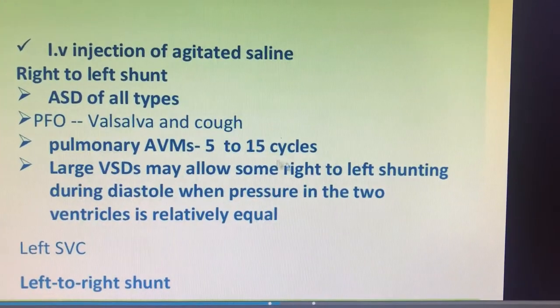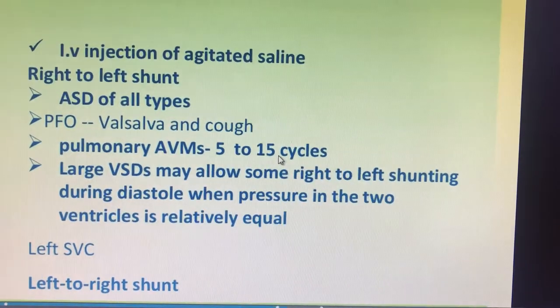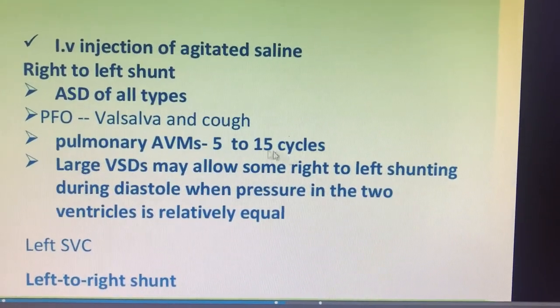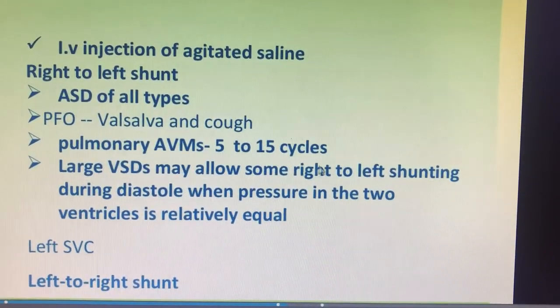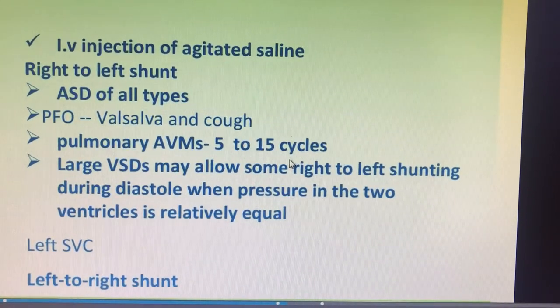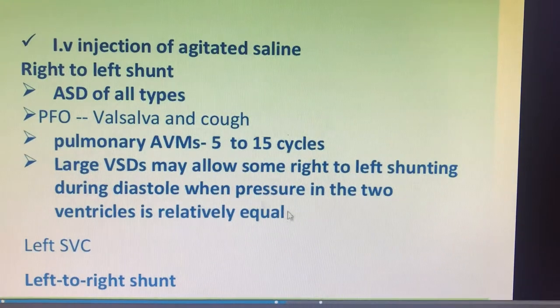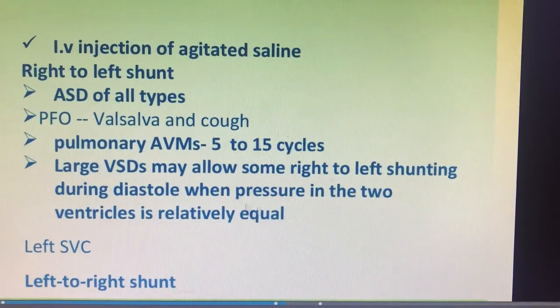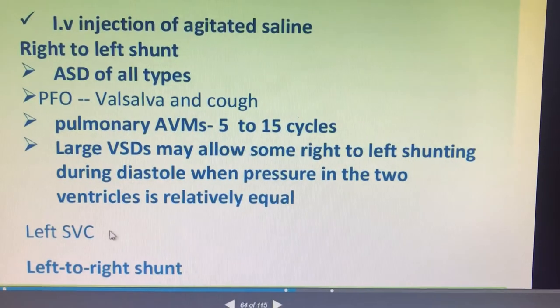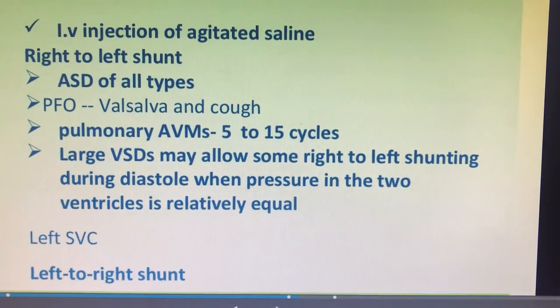For pulmonary AVMs, after 5 to 15 cycles you will get a delayed left ventricular opacification of the contrast — a slow filling of contrast in the left ventricle. Large VSDs may also sometimes have a right-to-left shunt that can be detected. And the left SVC is also very important, which we will be discussing further.